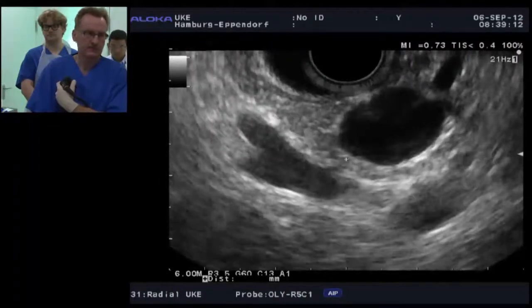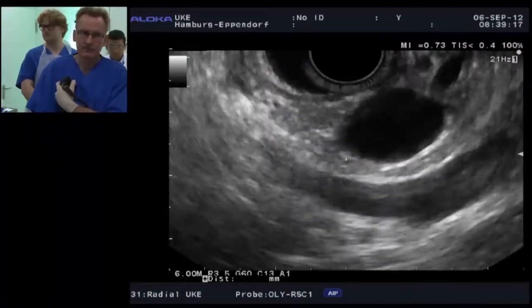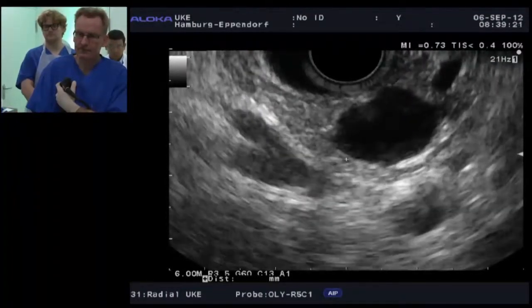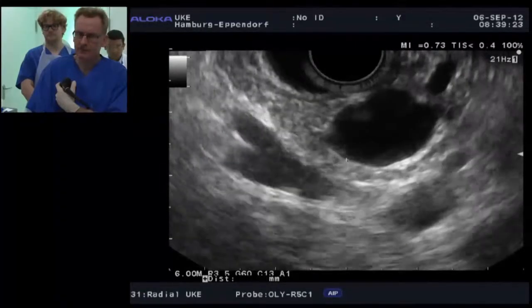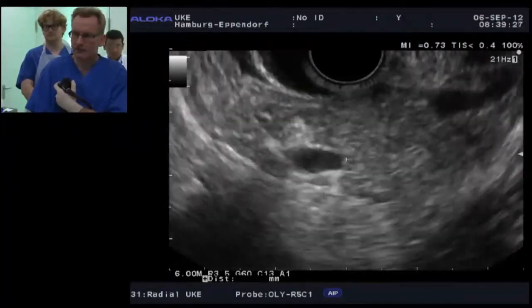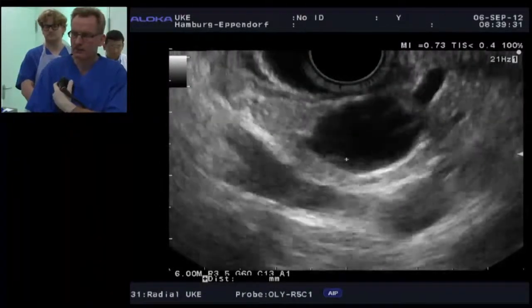Hello, this is Bill Brugge. I was wondering if you thought that the main pancreatic duct was dilated just proximal to the pancreatic cyst. And if the duct is dilated, do you think that there is obstruction, or do you think that there could be main duct IPMN?